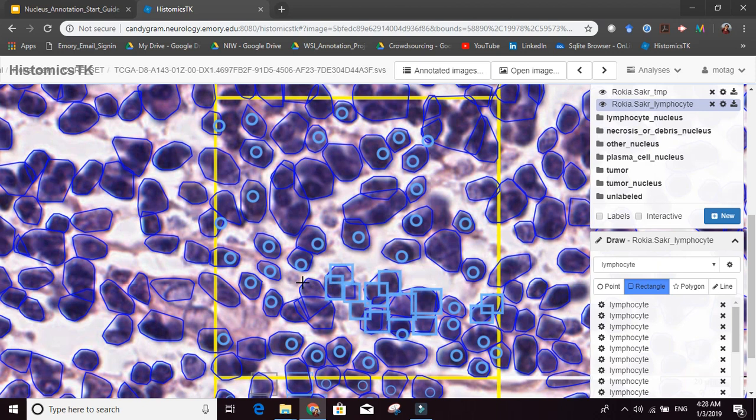So over here you can see this one is a lymphocyte, this one is a lymphocyte here, this one is a lymphocyte here. This one is actually a fibroblast, so I'm going to get back to it later. So let me just label all the lymphocytes first, okay, and then later on I'll show you what to do about these.